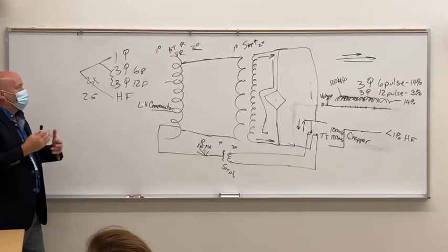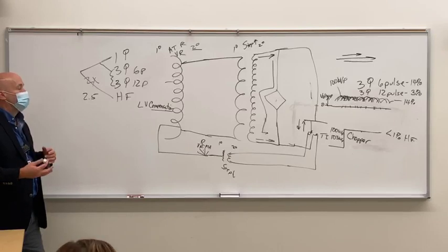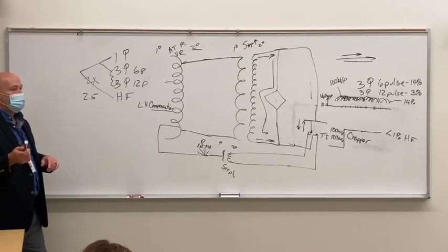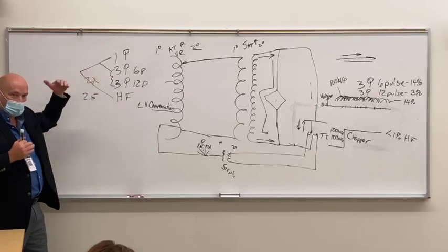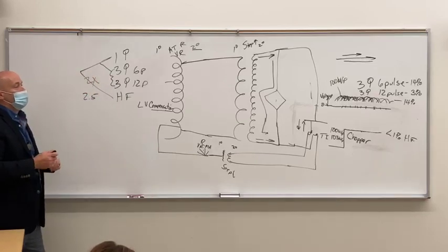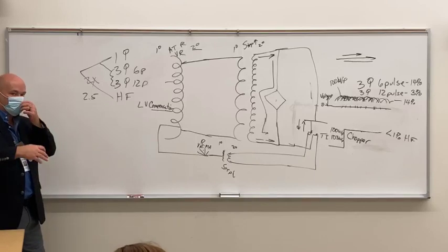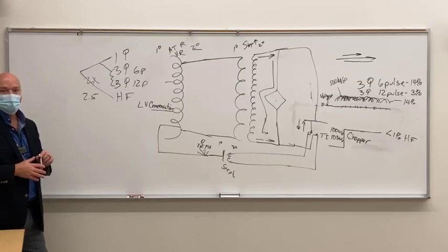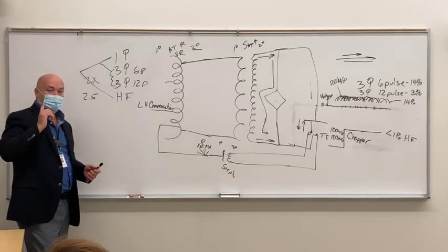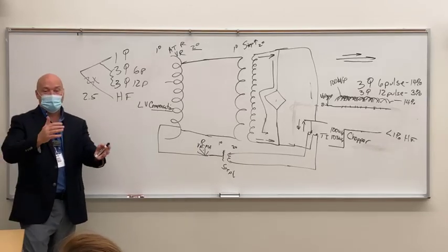So you're gonna have questions that say something to the effect of, if you make a good exposure in a single phase room, and for whatever reason you got to repeat the exposure to take a patient to a 3-phase room, then what are you going to have to do? You got the right idea, you're going in the wrong direction.